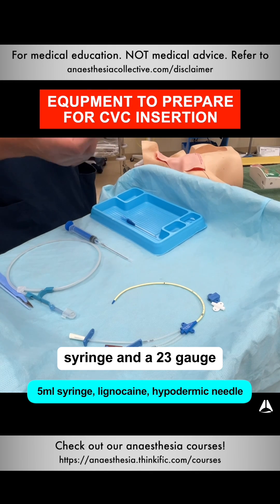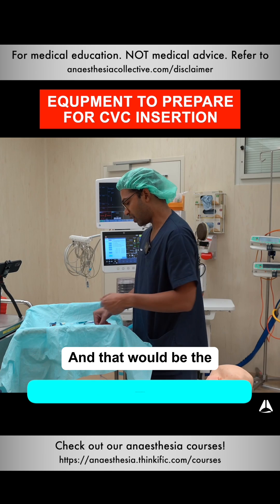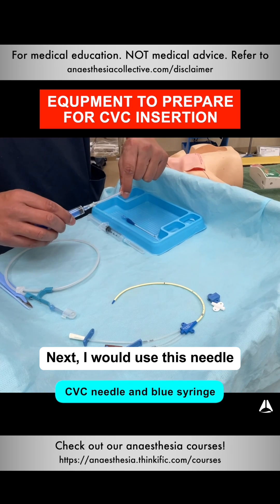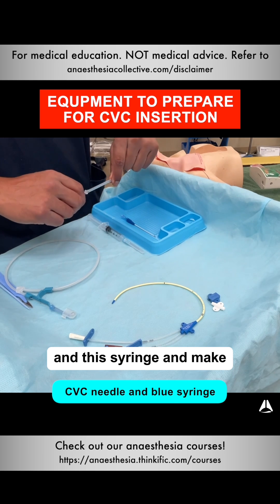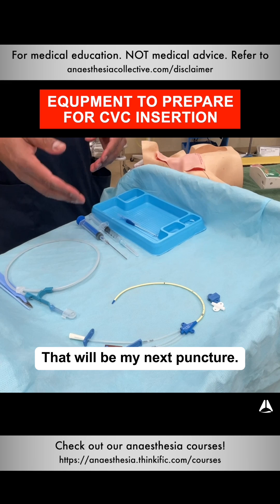I have a 5ml syringe and a 23 gauge hypodermic needle with some 1% lignocaine, and that would be the first thing that I use. Next, I would use this needle and this syringe, making sure that I've got the cap off and put in line. That will be my next puncture.